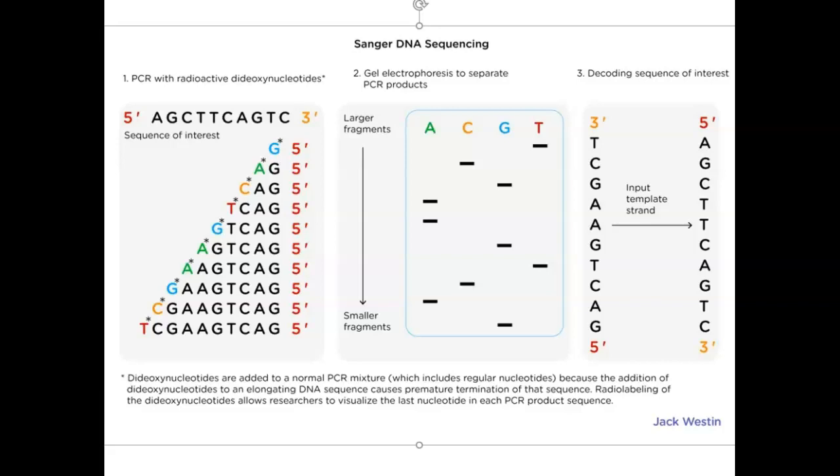We now have this technology which is cheap enough and fast enough, and I wouldn't be surprised within the next 10 years, while some of you are MLTs, that a lot of your testing for bacterial identification goes to a MALDI-TOF instrument or another type of genetic analyzer.